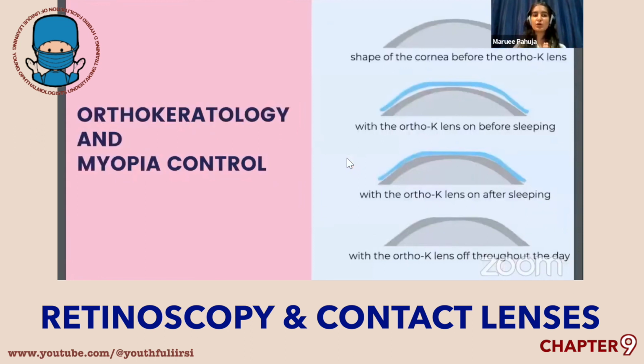Let's talk a little bit about orthokeratology and myopia control, because when you do refraction, you see patients with myopia. Especially in cases where you see a pediatric population having myopia, it's absolutely essential to tap into prevention of myopia. And the option available right now in contact lenses for myopia control, with or without pharmacotherapy, is orthokeratology.